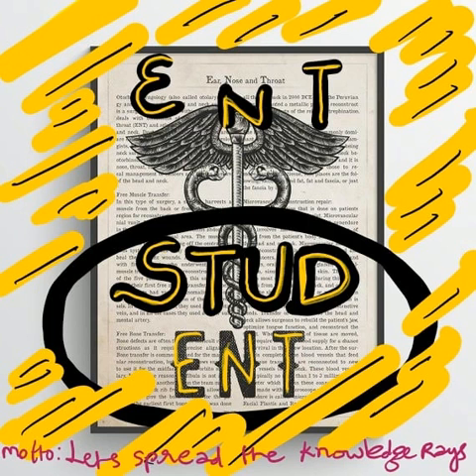The best way to expose the middle fossa dural plate is by drilling the cortex in the line of the linea temporalis until the bone color changes, which indicates the middle fossa is reached. This is performed using a large cutting burr, and this plane of exposure is followed into the antrum.